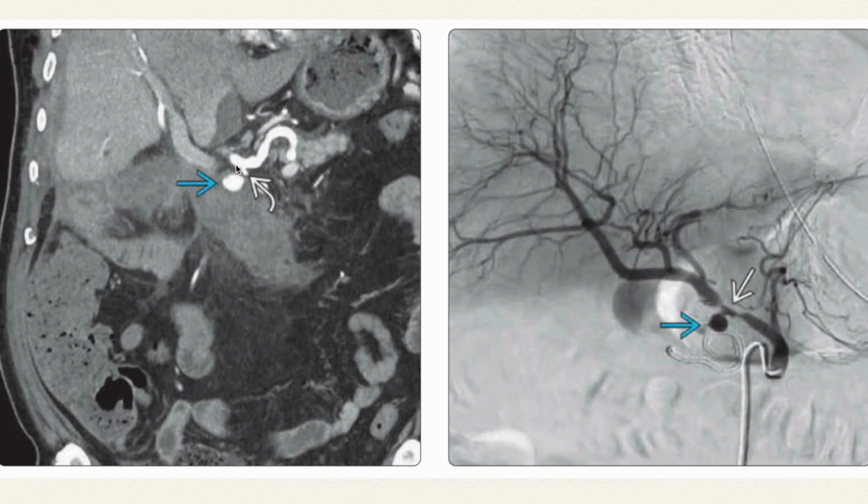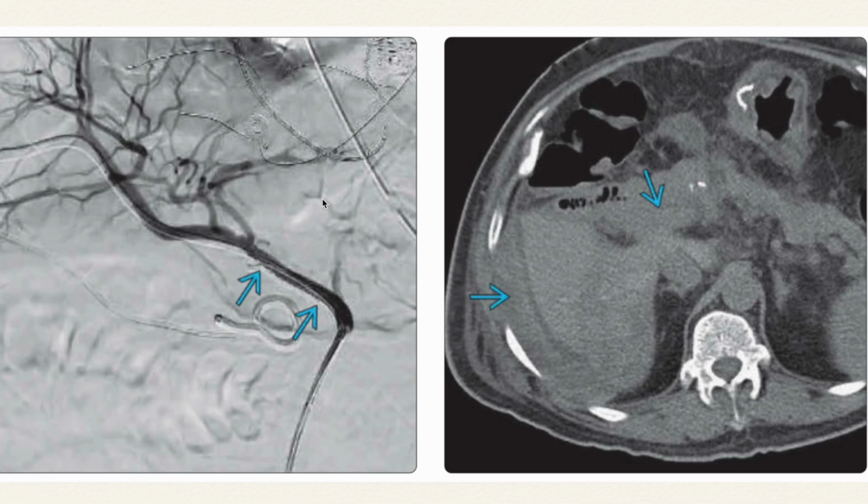So here the GDA is ligated surgically, and at the ligation site, at the stump, the GDA is having a pseudoaneurysm. As you can see, GDA is pretty proximal, and you have the proper hepatic artery divided into right and left. So here you would want to maintain the patency of this artery. So it is better to put a covered stent over here, which was placed, and you can see the whole artery has come to near normalcy. There is good patency and there is good flow distally.